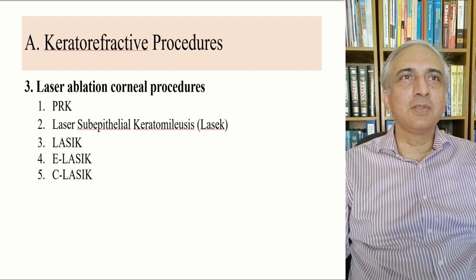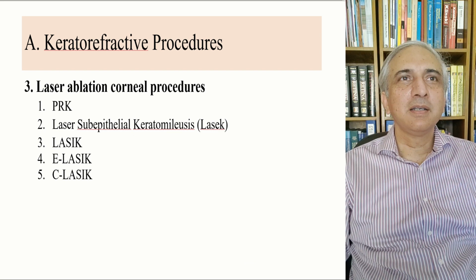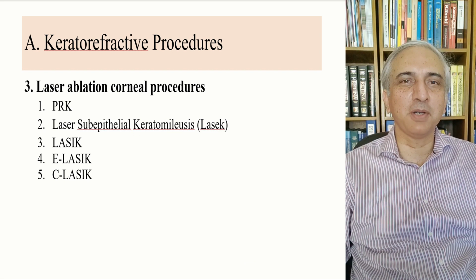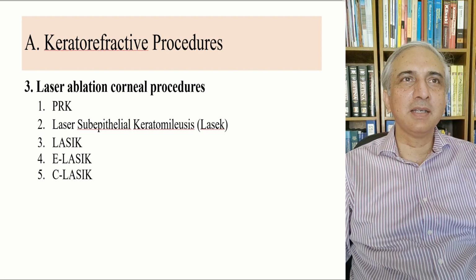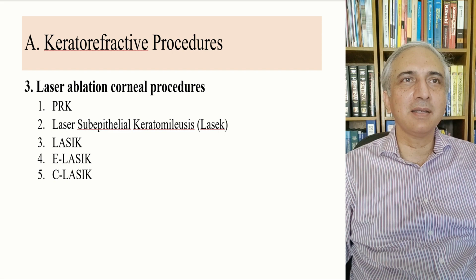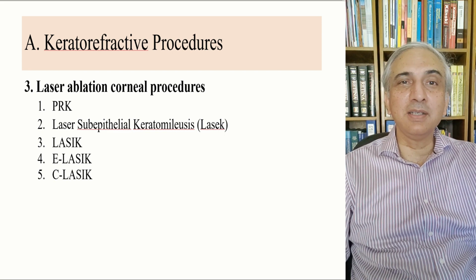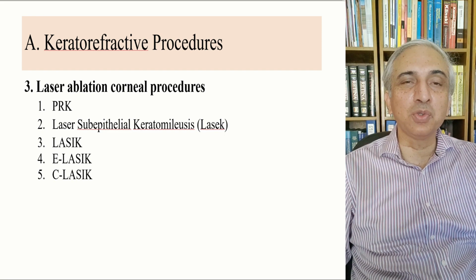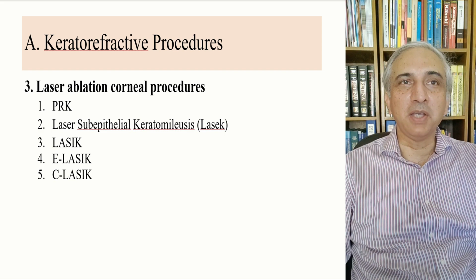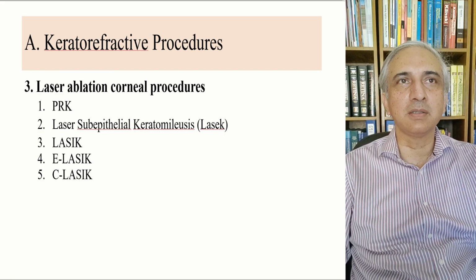Then we move on to keratorefractive procedures in which we involve laser. So there are laser ablation corneal procedures, and they include PRK, which is very popular. Then we've got LASEK, laser subepithelial keratomileusis. Then we've got LASIK, then E-LASIK and C-LASIK. So these are actually the norms in society which you should know as an ophthalmologist, even if you're not doing them, because patients will probably know better than what you know in that instance.